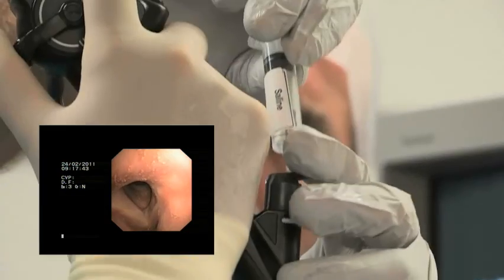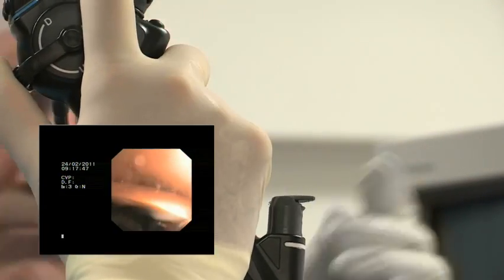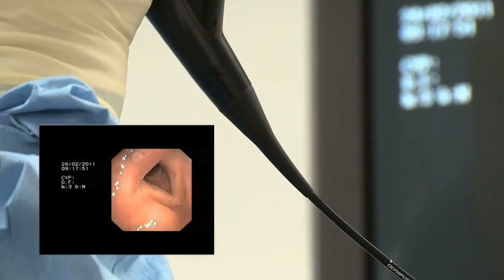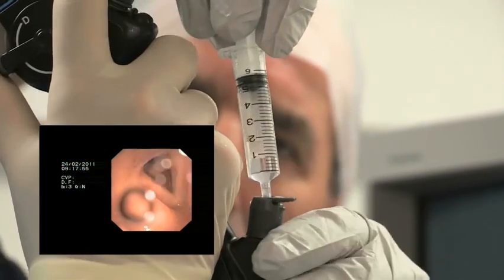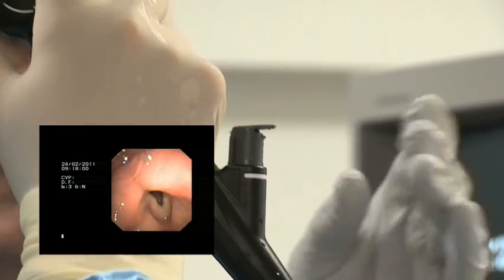We have found that the use of an epidural catheter is not required to facilitate dispersal of spray if an air chaser is used to achieve a good jet. It is important to aim the scope at the cords and epiglottis to ensure good bounce and coverage.